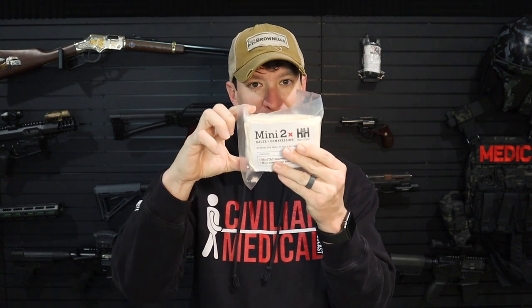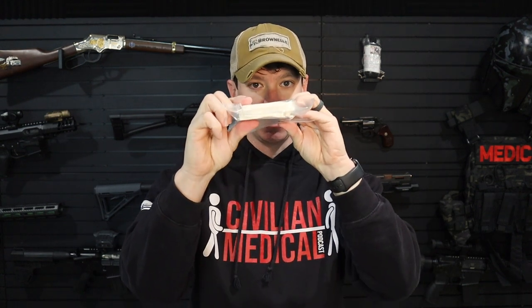It's going to be a pressure bandage and compressed gauze. The overall dimensions are almost five inches long, about three and a half inches wide, and about an inch thick. Speaking of having a small package, I wanted to build a trauma kit using the Mini 2X. Maybe this gives you some ideas on building your own trauma kit.